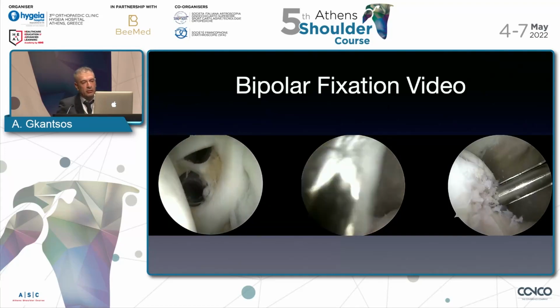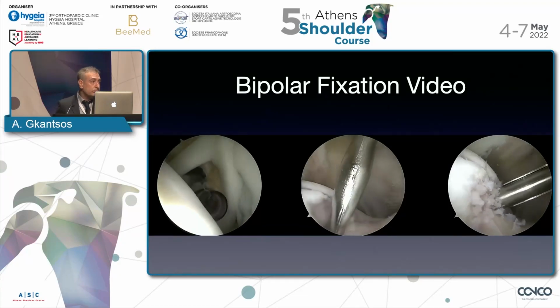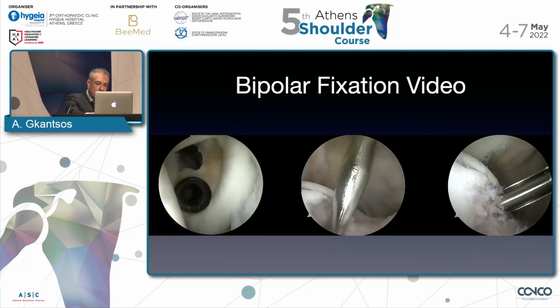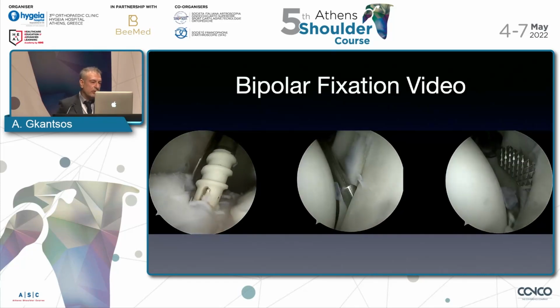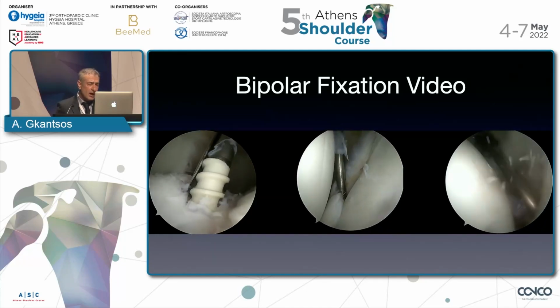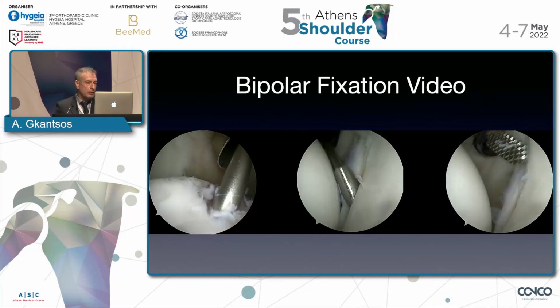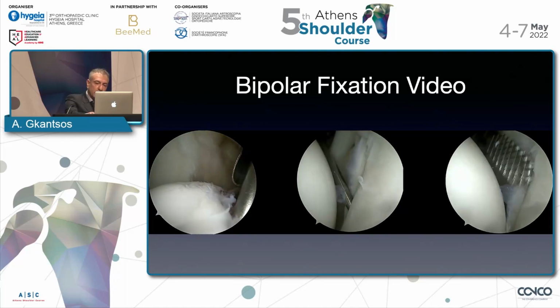If we use large rotator cuff anchors, I think that tapping is necessary because we're talking about hard bone with high density. Then we put the anchors in the standard fashion, and then, after we settle the sutures, we finish the remplissage, we get to work to finish our labral repair in the standard fashion.